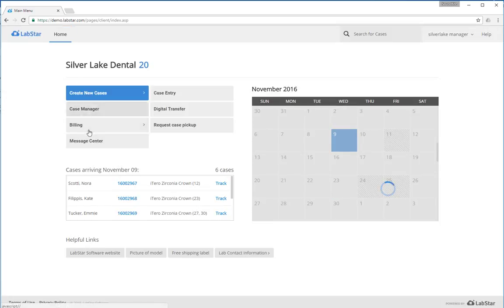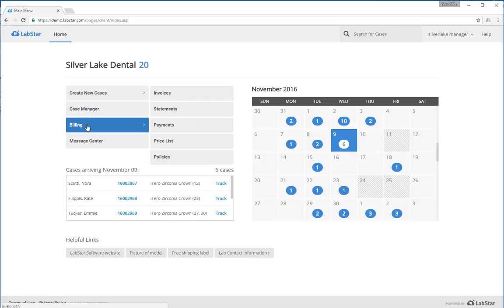The billing section allows you to view your invoices, statements, payment history, and even your price lists.